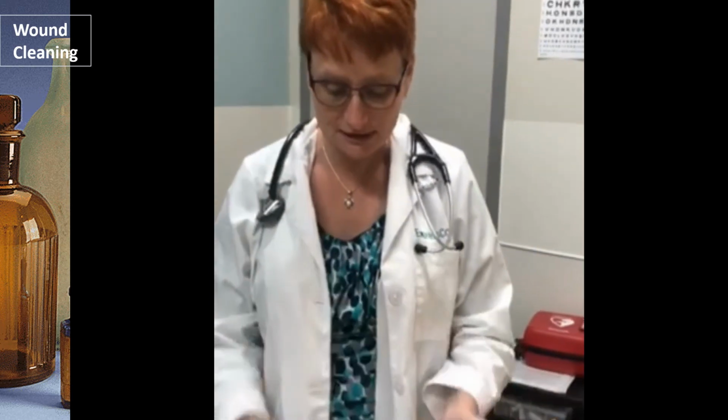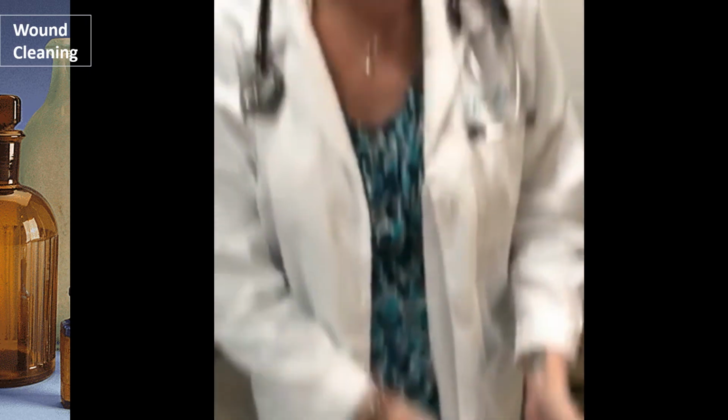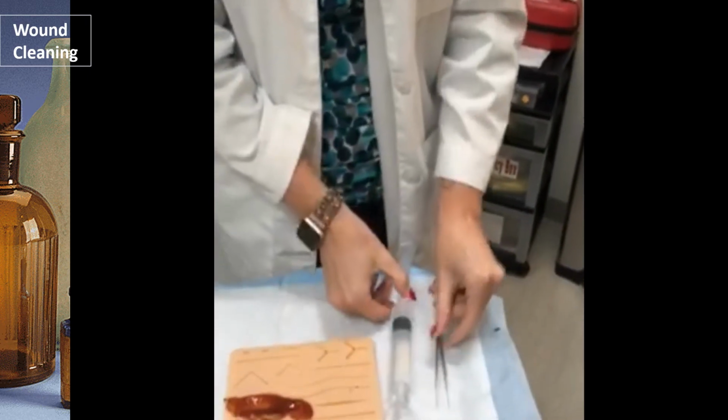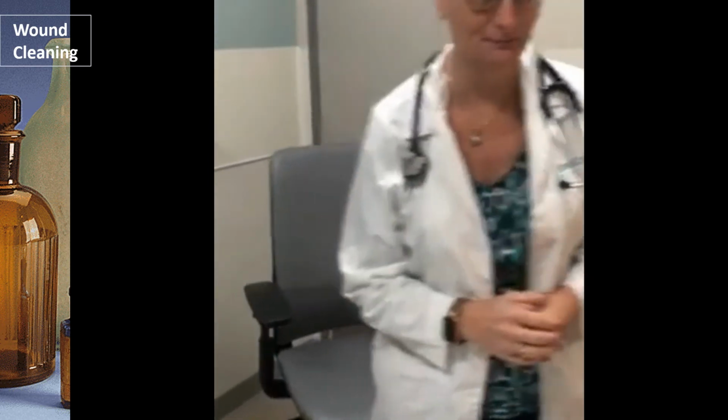Good morning. This is Susan Gillespie. I am the nurse practitioner and your instructor for this class. I would like to show you today how to do a proper wound irrigation and cleaning of debris, making sure that there are no foreign bodies. All right, so you'll see in front of me today I have our practice skin. I have tweezers and forceps, my irrigation. So the first thing I'm going to do is glove up. We always want to make sure that we take care of ourselves first.